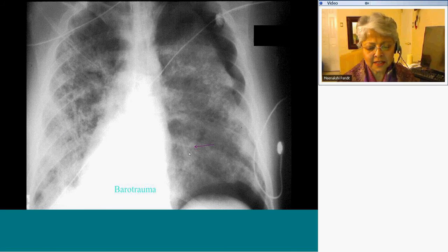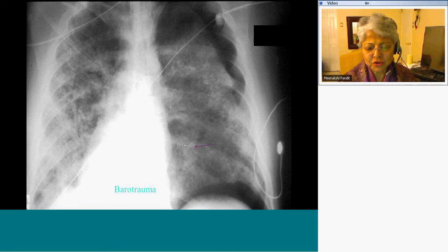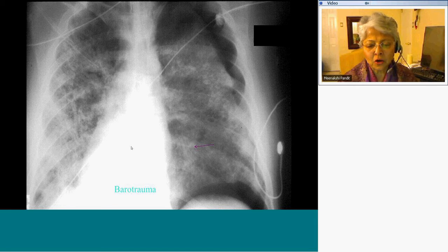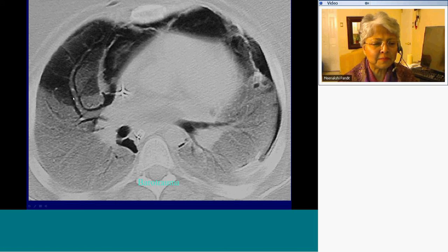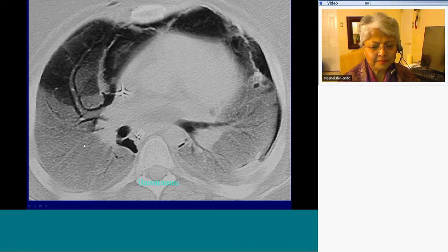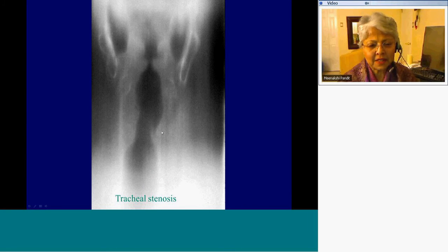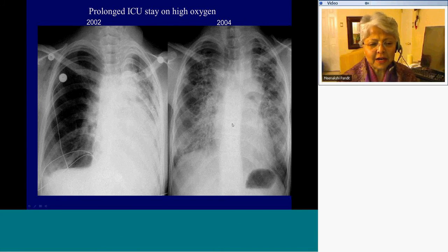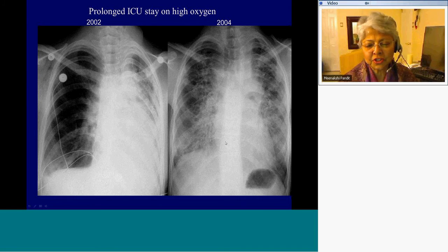This is a patient with ARDS on very high PEEP. You can see bilateral alveolar opacity, but there is also tram tracking caused by lucencies — air along the blood vessels, which is interstitial emphysema. The CT demonstrates tram tracking of air caused by interstitial emphysema, and this patient also has pneumomediastinum and pneumothorax. This frontal tomogram shows tracheal stenosis caused by prolonged endotracheal tube placement. These radiographs obtained two years apart show someone on high oxygen for prolonged periods who developed coarse reticulonodular and cystic-appearing lucencies in both lungs.